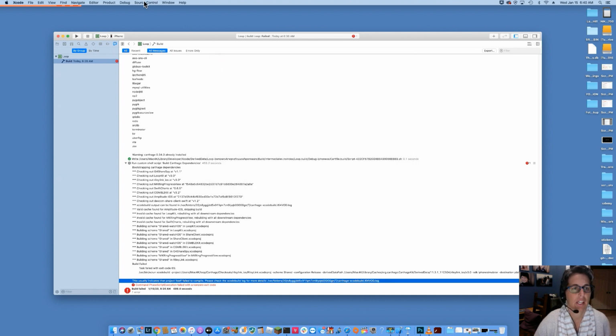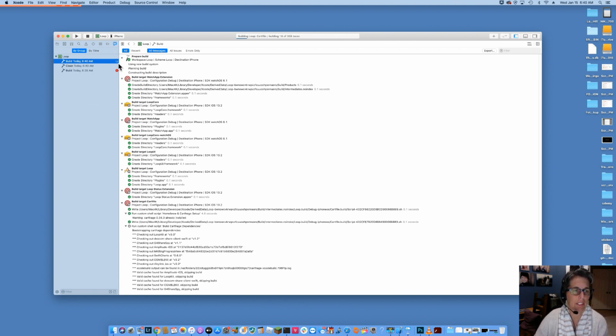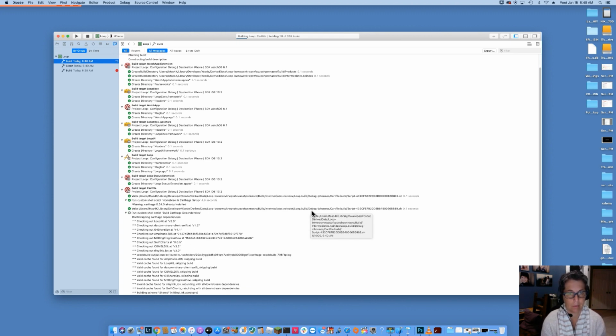That's good. So then the very next thing I'll do is I'll go to the product menu up here, and the drop down is clean build folder. So I clean the build folder, and it says clean finished. That goes really fast, and I press play again. So now I'm going to watch it here. The build that's active will have a little spinning circle, and we'll see if it gets past that issue this time. And so we wait.